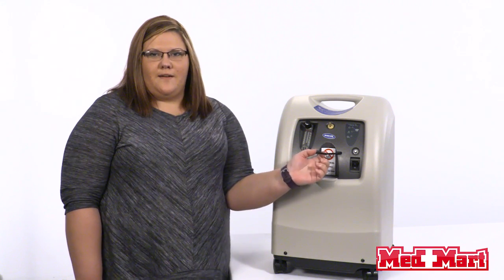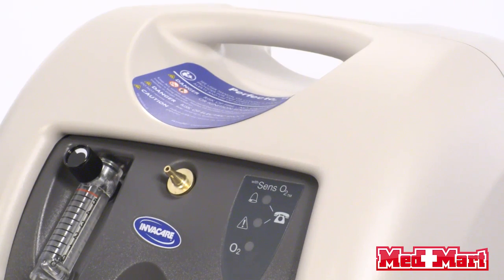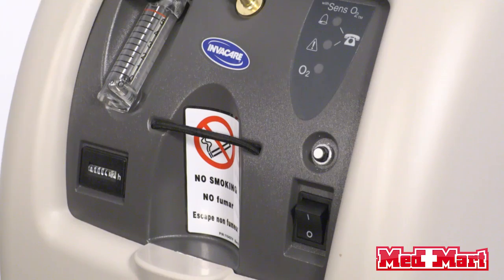Most concentrators on the market today have a plastic nipple. Another thing we like about this concentrator is it holds your humidifier bottle right here — you pull that string out and your humidifier bottle will go right in there. Also, this concentrator runs cooler, which reduces condensation in the tubing and helps lessen the need for a humidifier. With the humidifier bottle, the only time you'll need it is if you feel dry or you're getting a lot of nosebleeds.